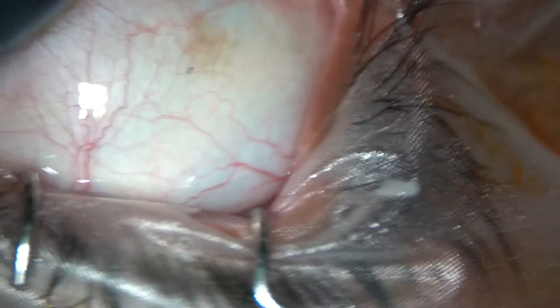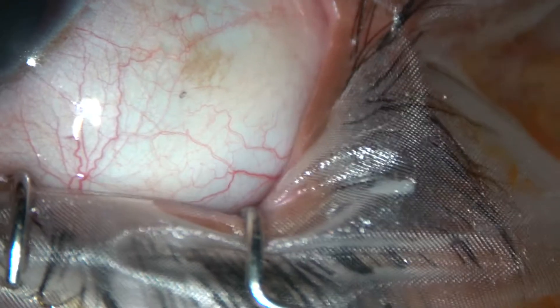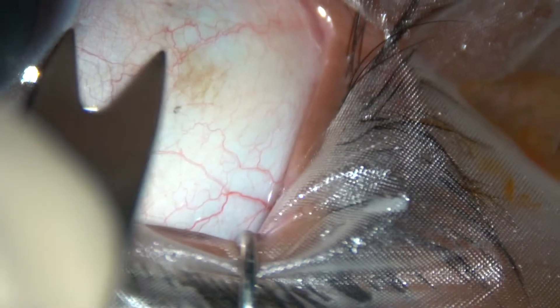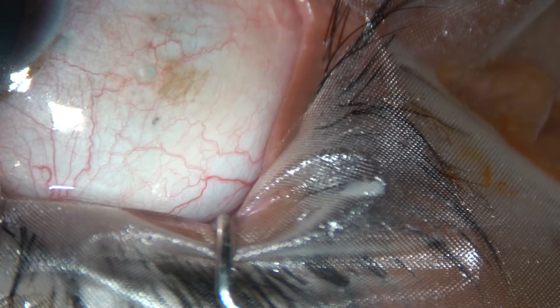Dear colleagues, this is how I inject intravitreal anti-VEGF. A caliper is taken. A measurement of 3.75 mm is done in case of a phakic eye, and 3.25 mm in case of a pseudophakic eye.